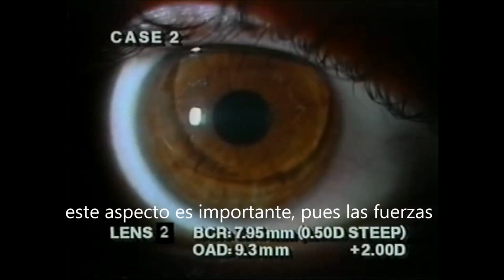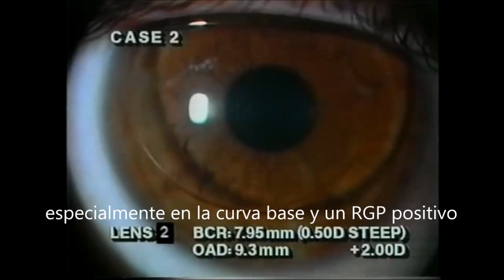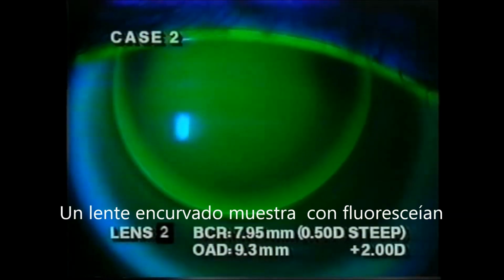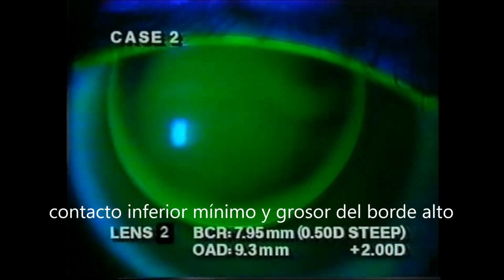This improvement may be attributed to the centrational forces of a steeper base curve, along with the greater mass characteristics of a plus power RGP. A steep fitting relationship can be observed with fluorescein. Minimal mid-peripheral bearing and inferior pooling is present.